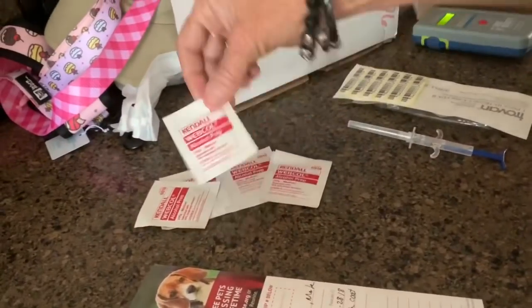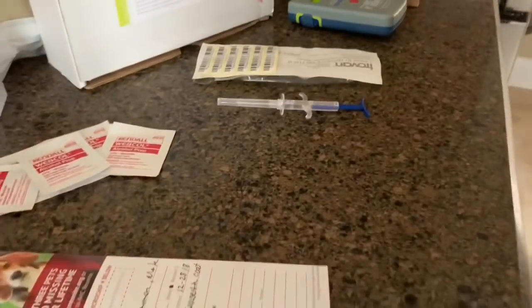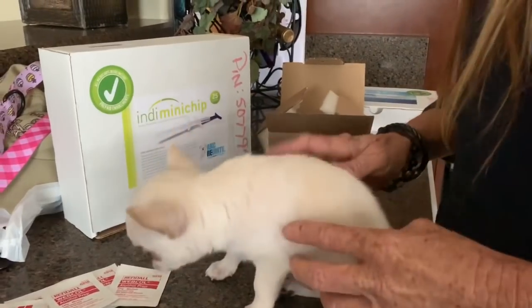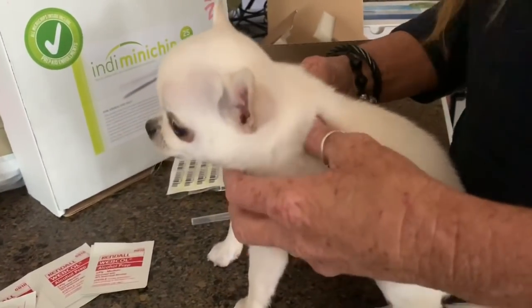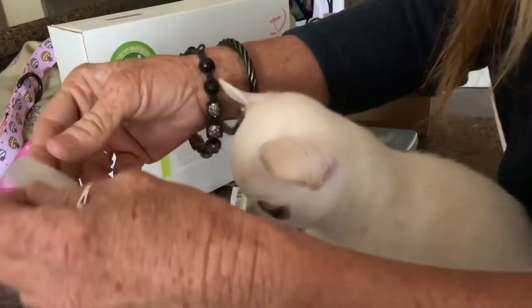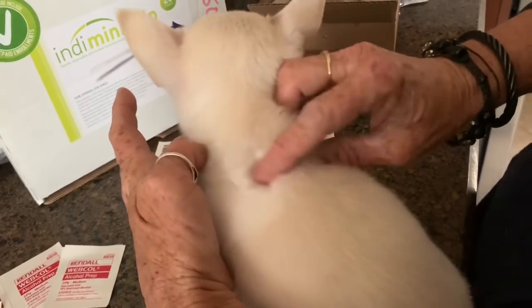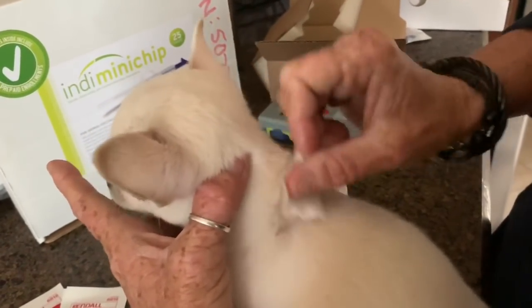We have the alcohol swabs. Before we inject, we have our little injection device with the microchip inside, and I'm going to get baby. This is little Lumi — he is eight weeks old and he's going to get microchipped today. You always microchip right between the shoulder blades, and sometimes they do migrate, so that's something you've got to watch for. We take the alcohol swab — we've washed our hands beforehand. Get the hair out of the way, feel where the shoulder blades are, and get right down to the skin in this whole area to make sure you're not introducing any kind of bacteria into his body while you inject.